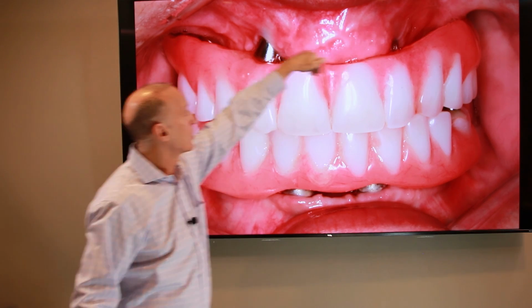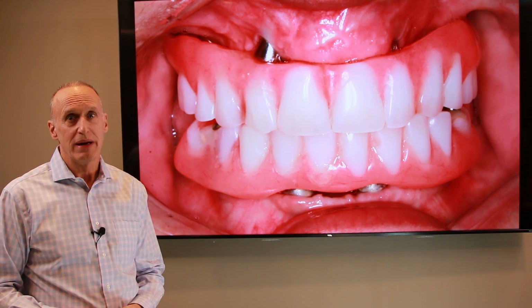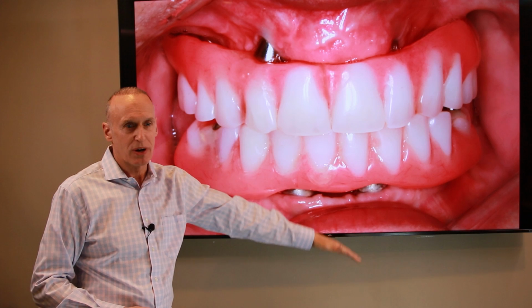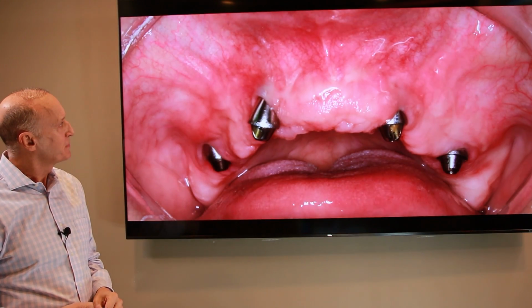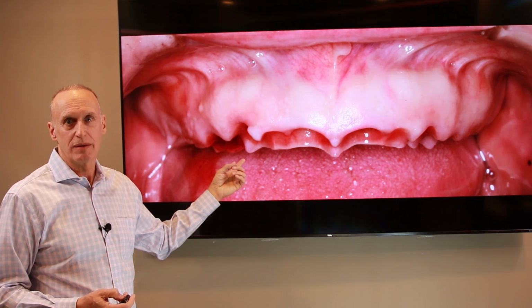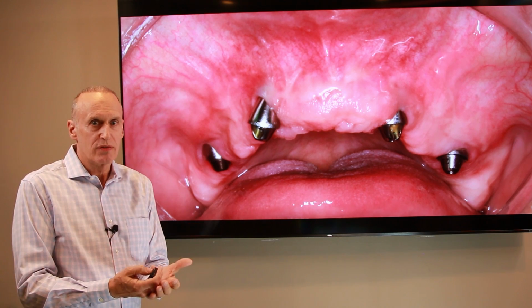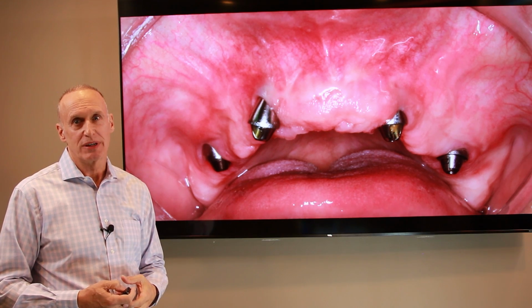But everywhere else along the border of this is uncleansable also. It's concave instead of convex. You've heard me rant about that in many other videos, and if you haven't, we'll link some of those to this video as well. But anytime your abutment or your implant is above the gums, you can't make your prosthesis cover it. So anyway, let's just go back for a second. Which one would you want? An implant bridge where you've saved all your bone and gum tissues? Or an all-on-4 where they've cut it all away and had to put the implants at crazy angles? Again, I know it's a rhetorical question, but this is what you're faced with. Even if you find a really, really good all-on-4 doctor, you're still not going to be able to clean your prosthesis.